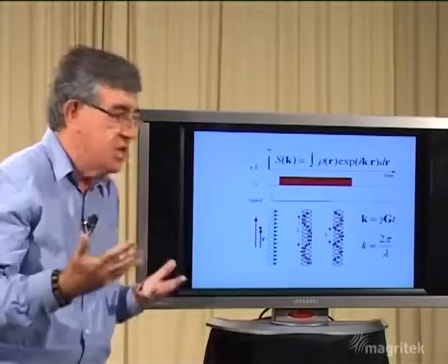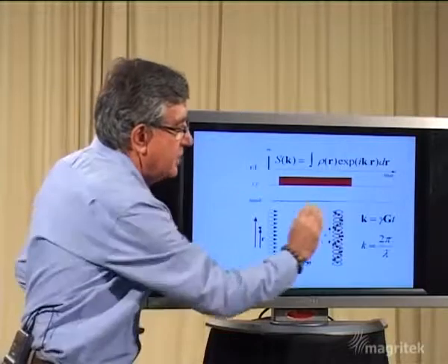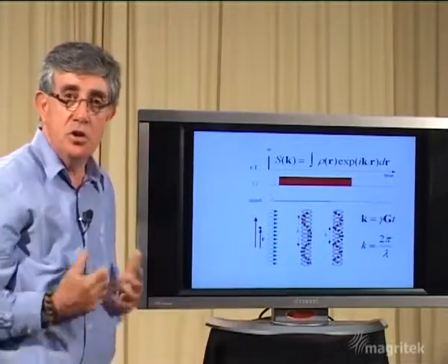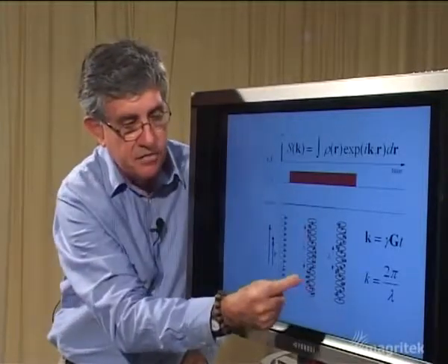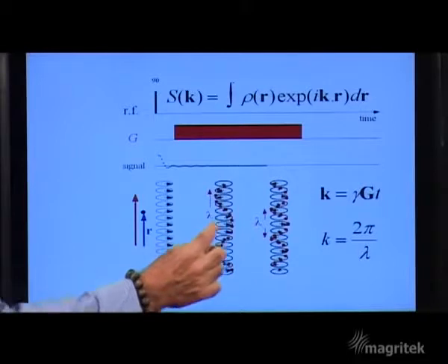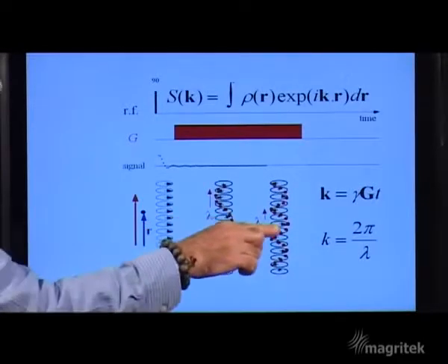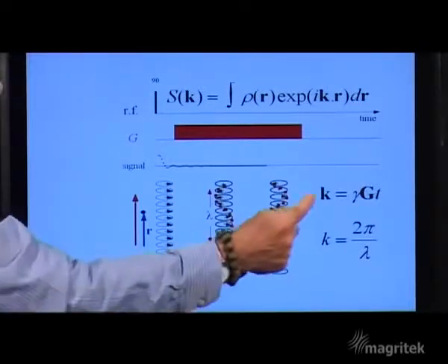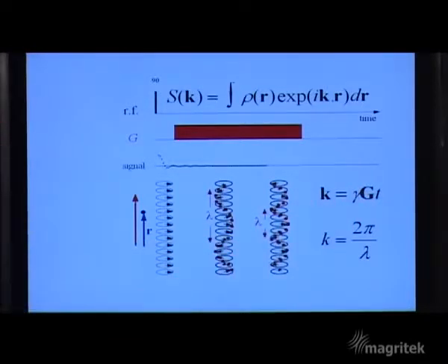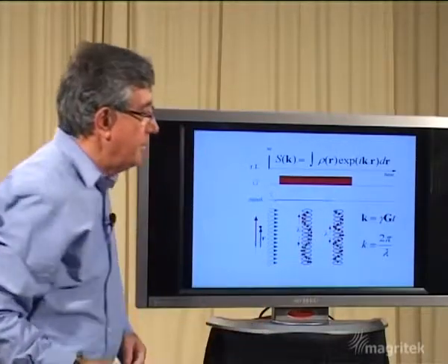Let's look at the pulse sequence that we would use with a normal time course of events starting with a 90-degree pulse and seeing how things evolve with time when we're using 2 or 3-dimensional gradients. Again, the same idea of a helix of phase wound up, which gets a pitch which is shorter and shorter with time, the wavelength decreasing, the wave vector or K-space value increasing with time. Now we write K-space as a vector relating to the vector of magnetic field gradient. It's a product of the field gradient vector and time.